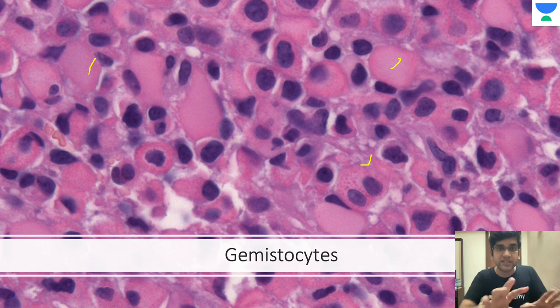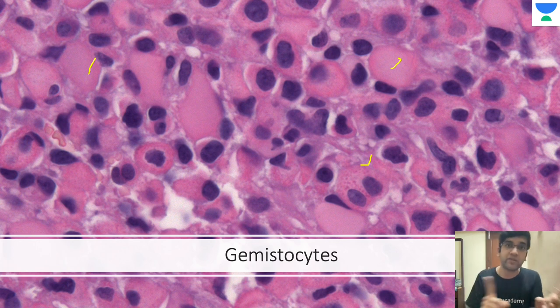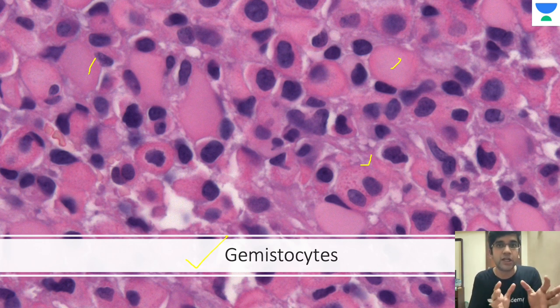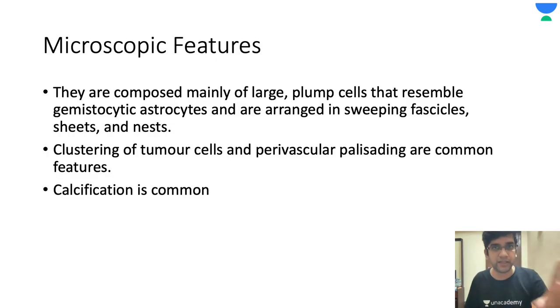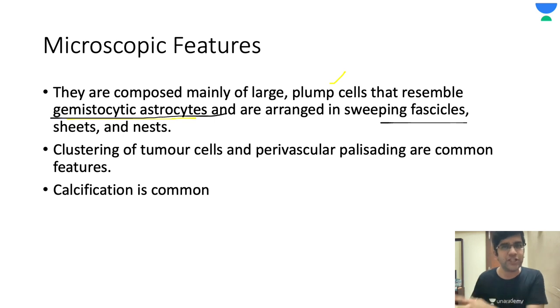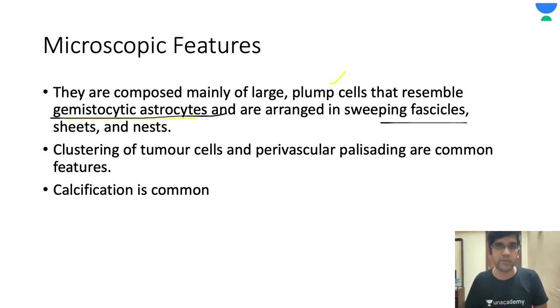At higher power, SEGA will be more oval, not elongated. To differentiate from gemistocytic astrocytoma — to call it gemistocytic astrocytoma, I should have an astrocytic background with more than 20% gemistocytes. That's all. The cells in SEGA are large plump cells which resemble gemistocytic astrocytes, but they are not gemistocytic astrocytes. The most important thing is they are in sweeping fascicles, sheets and nests of cells, divided by a tiny thin septa — very, very classical.